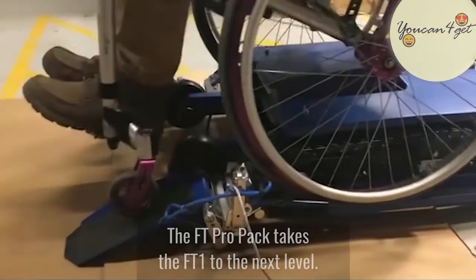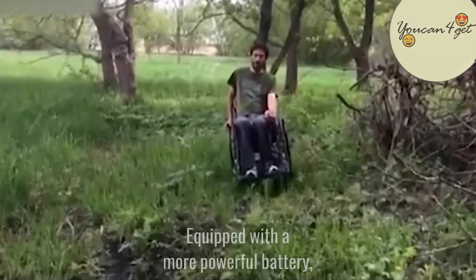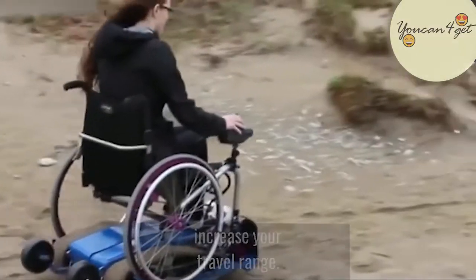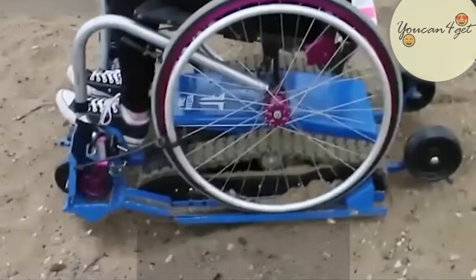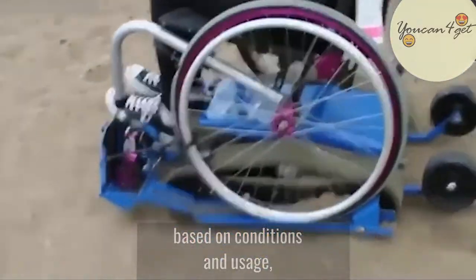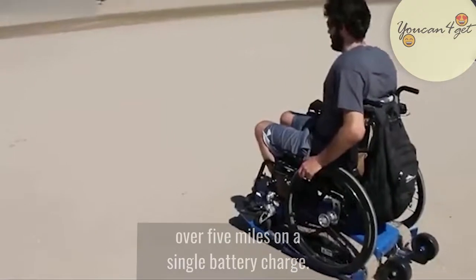The FT Pro Pack takes the FT1 to the next level. Equipped with a more powerful battery, this robust model will significantly increase your travel range. The range for all models will vary based on conditions and usage, but typically you will see an operating range of over 5 miles on a single battery charge.